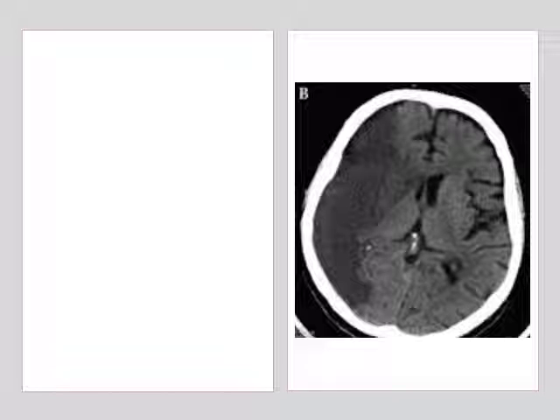At first, can you describe this CT scan? This is an axial cut, right? This is the lateral ventricle, okay? So, in front of it is the frontal lobe. This is the occipital lobe. And here is the third ventricle, so this is the temporal lobe. Can you identify any abnormality here? Look, this part, we see it is more dark than the normal brain tissue, so it is called a hypodense lesion.